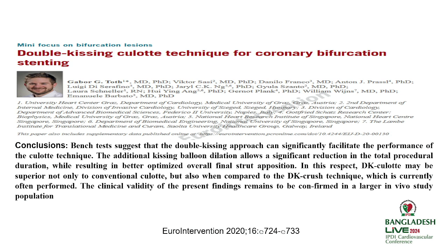Their bench test suggests that the double kissing approach can significantly facilitate the performance of a Culotte technique. The additional kissing balloon dilatation allows a significant reduction in the total procedural duration, while resulting in better optimization of overall final stent apposition. In this respect, DK Culotte may be superior not only to conventional Culotte, but also compared with DK crush technique, which is currently often performed. The clinical validity of the present findings remains to be confirmed with a large in vivo population trial.